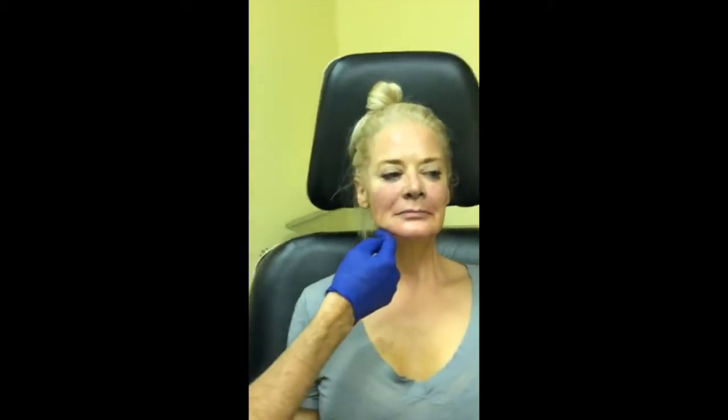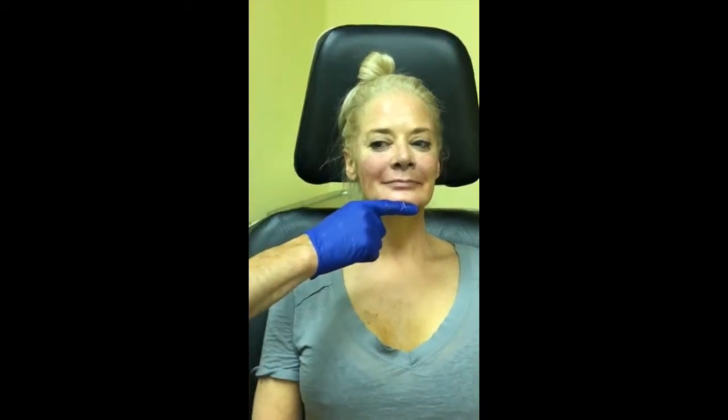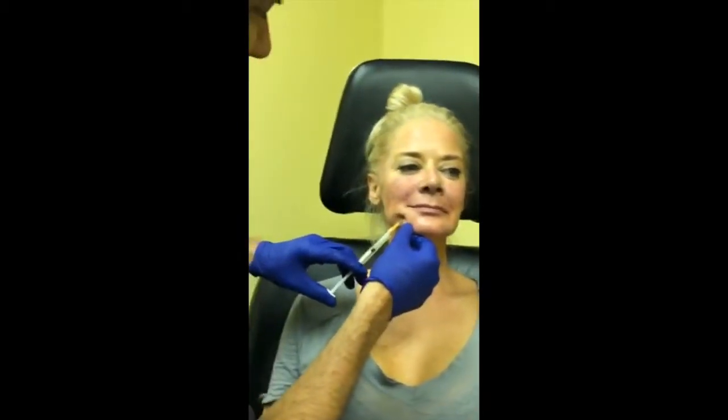What I'm doing right now: I can feel there's a little bit of jowling right here, and I'm filling in the transition between that jowled area and the front of the chin. I don't want to put any in the chin itself on Tanya because she already has good chin projection — we don't want to make it too big. But filling that little dip hides the jowl. I'm also going to fill up into a little triangle from the corner of the lip — filling that also tends to look really attractive. I've been doing some of this filling down by the bone, and touching bone with the needle dulls it almost instantly.